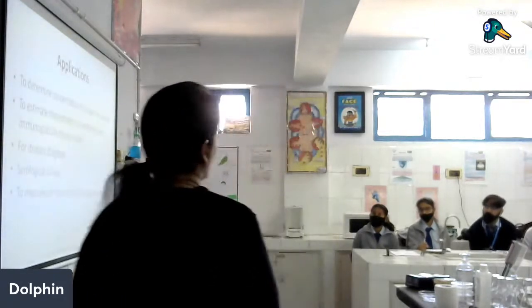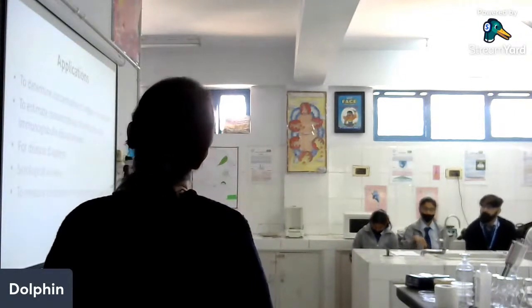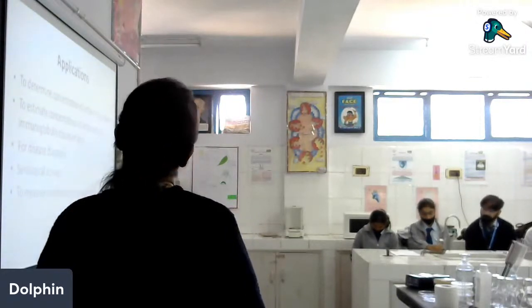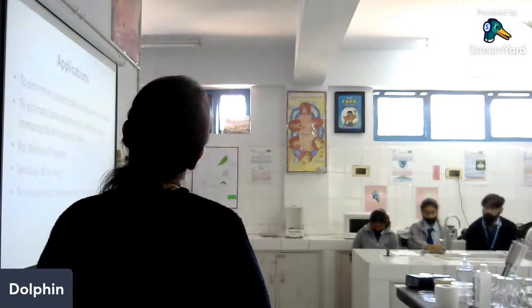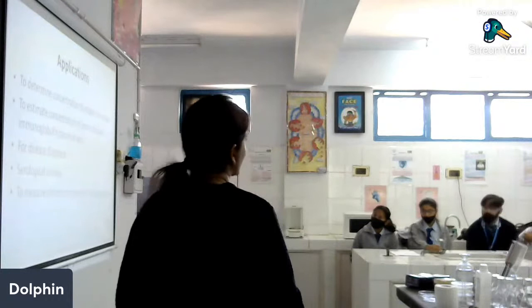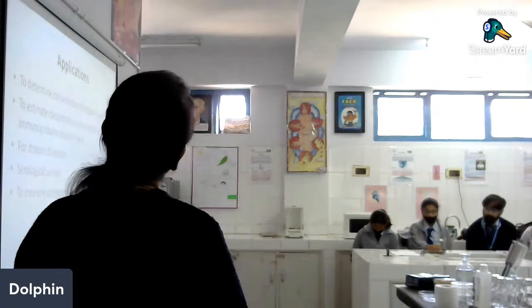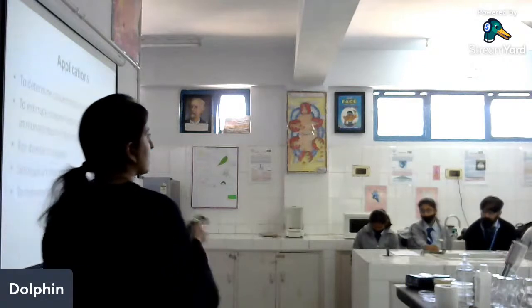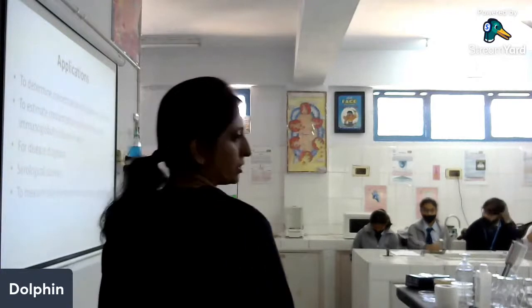So what are the applications? Now we know you can determine the concentration of antigen in the sample using this technique. You can estimate the concentration of antibodies in the serum, and you can also estimate the immunoglobulin classes in the serum. You use this technique for disease diagnostics. So this is used in diagnostic immunology. Small laboratories still use this technique for diagnostic testing, right? Serological surveys, as I said, to find out what proportion of the population has antibodies against a particular pathogen, against a particular disease-causing agent, right?